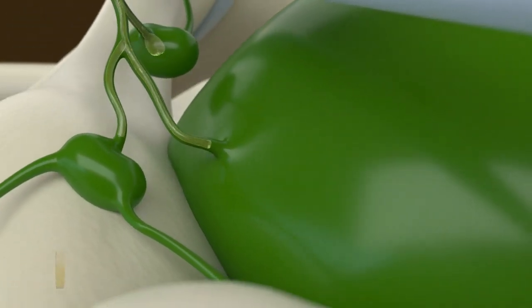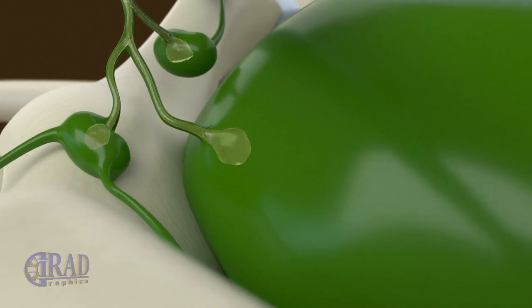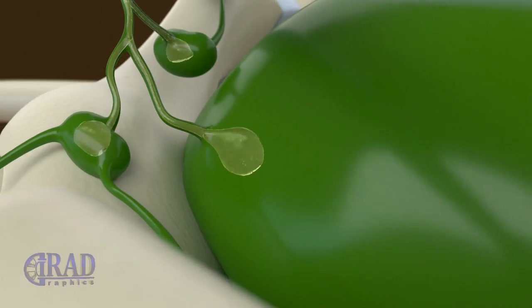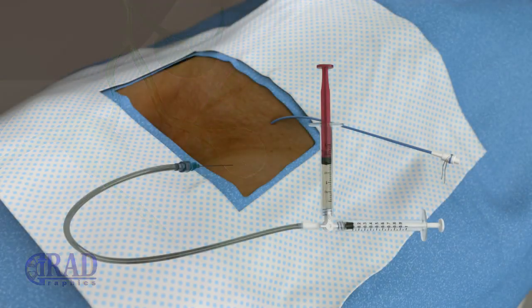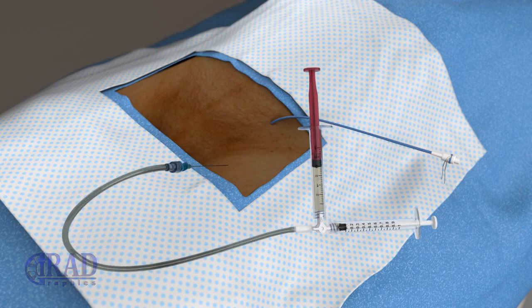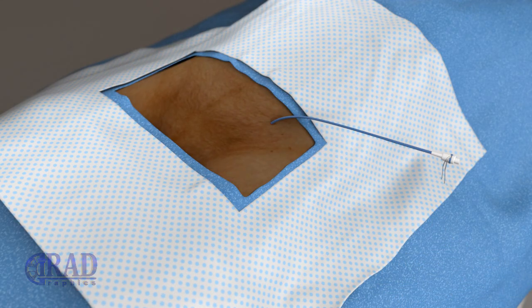by creation of a dumbbell-shaped contrast at the leak site. Once confirmed, the needle is removed at the end of the procedure.